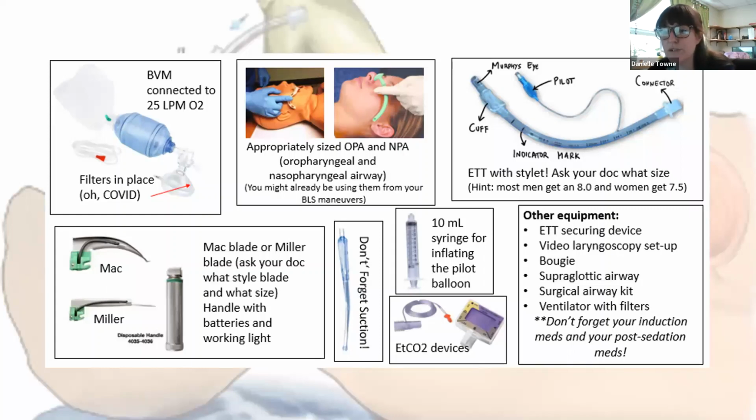You need a 10 ml syringe for inflating the pilot balloon. You need a Mac or a Miller blade with your handle, and you'd ask your provider what size Mac or Miller blade and which one they would prefer.